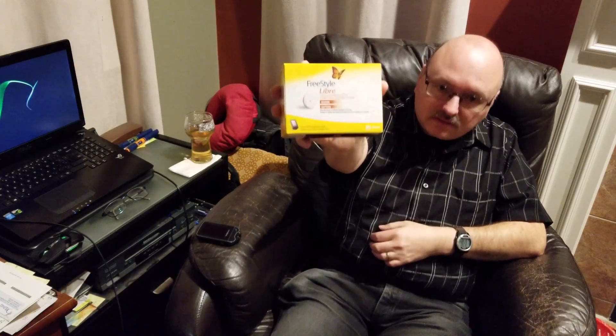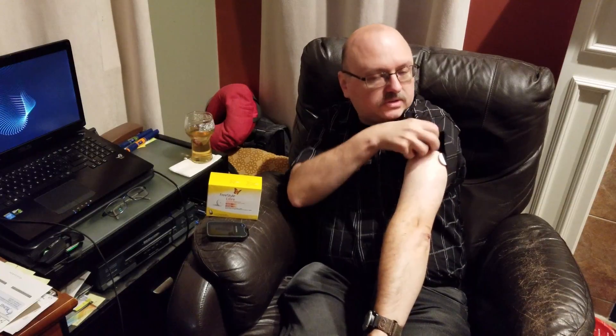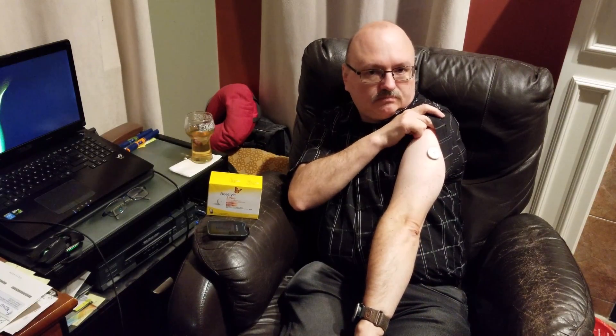It is called the FreeStyle Libre, and it's a flash glucose monitoring system. It has a sensor built in — that's the product. And this is the reader; you'll see how that works in a minute. I've got one on right now, so I'm going to show you the entire process. The sensor sits embedded on your arm. I know it sounds worse than it actually is. You put some alcohol swab around it and it'll come off. It looks a little nasty when it comes off, but not that bad.